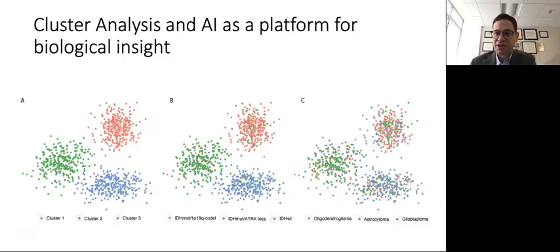We've also recently appreciated the power of unsupervised learning to predict previously unknown prognostic determinants of gliomas. Using a clustering method on our SRH image low-grade glioma dataset, we identify 3 clusters that align well with genetic subtype and increasingly, but not surprisingly, less well with morphologic criteria.